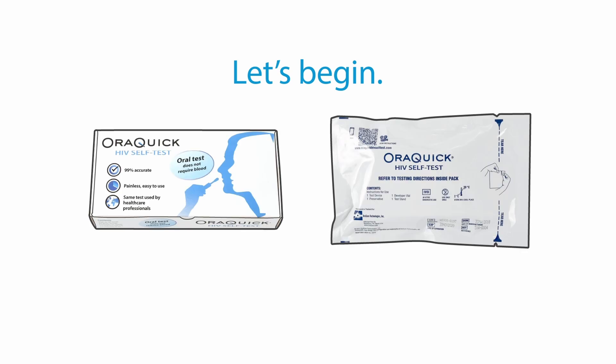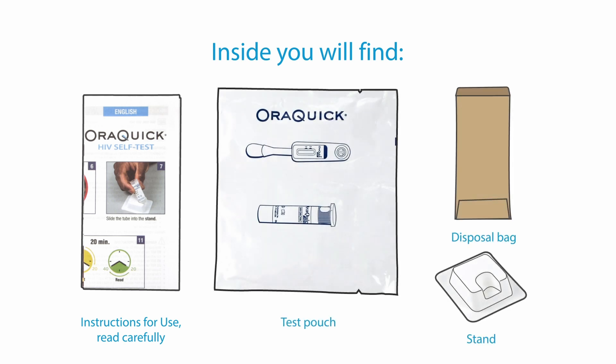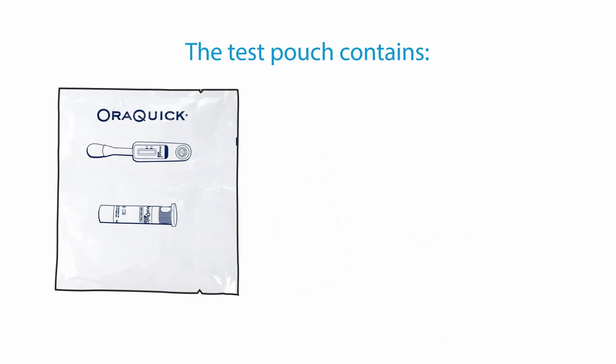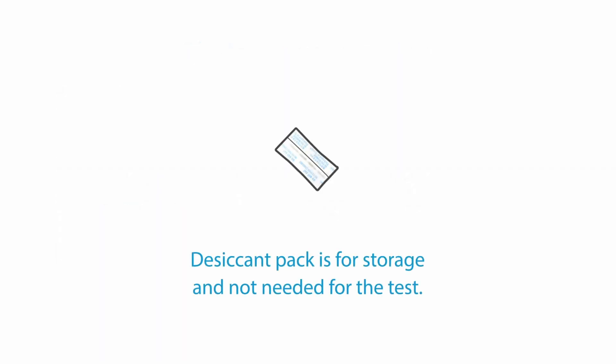AuraQuick HIV self-test comes in either a box or outer pouch version. Let us open the packaging. Inside, you will find the instructions for use. Please take a moment to read through it carefully. There is also one test pouch, one stand, and one disposal bag. The test pouch contains one developer solution, one collection device, and one desiccant pack.